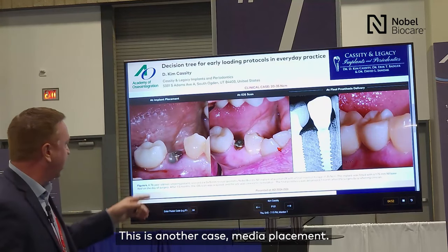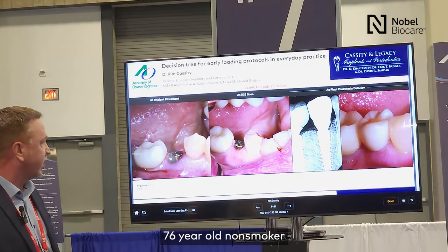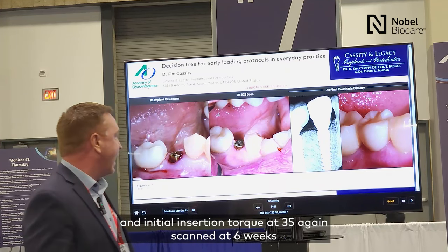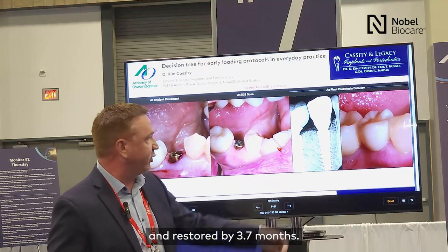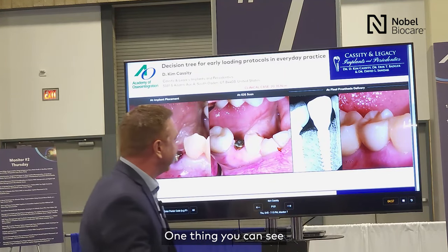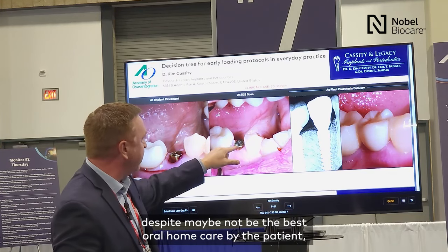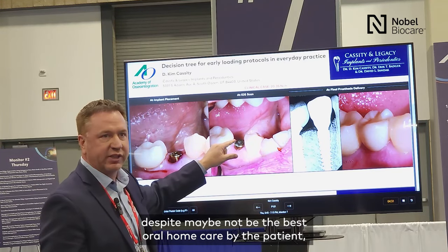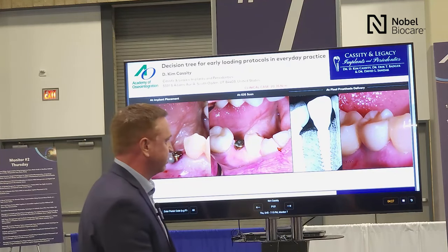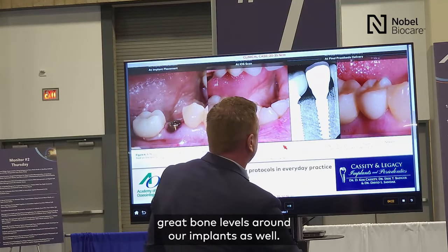There's another case — immediate placement, 76-year-old non-smoker, initial insertion torque of 35 newton centimeters. Scanned at six weeks and restored by 3.7 months. One thing you can see on these cases is just the quality of the soft tissue. Despite maybe not the best oral home care by the patient, we're seeing very nice thick pink tissues.